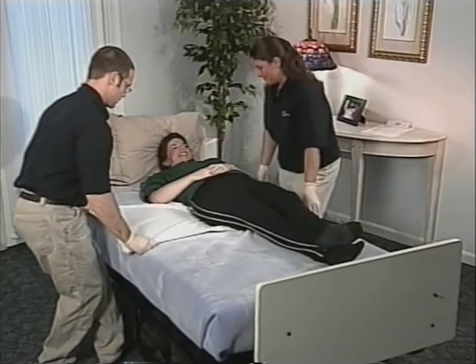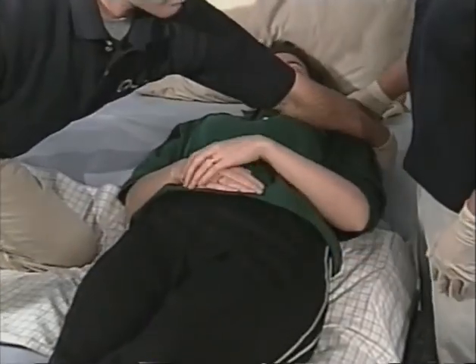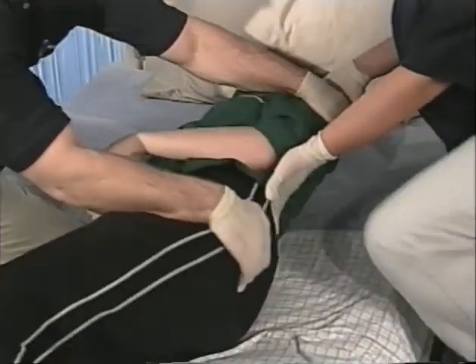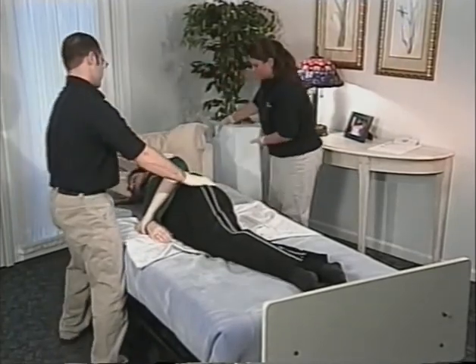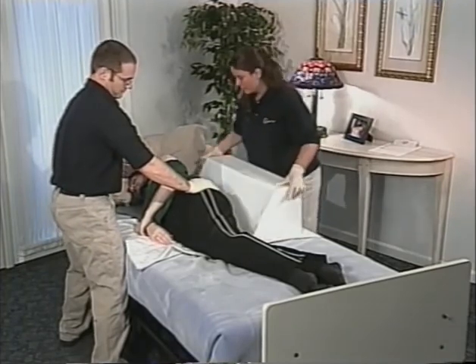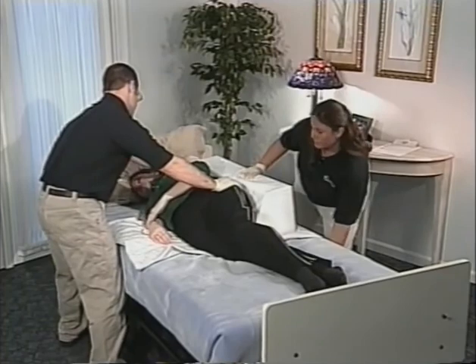To turn the client on their side, put your hand behind the shoulder blade and hip, keeping the spine in alignment. Position the bed wedge securely behind the client to support the trunk, and bring the bed rail up to secure.